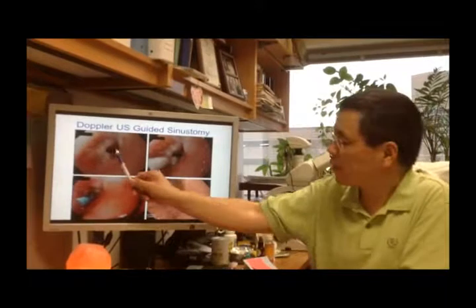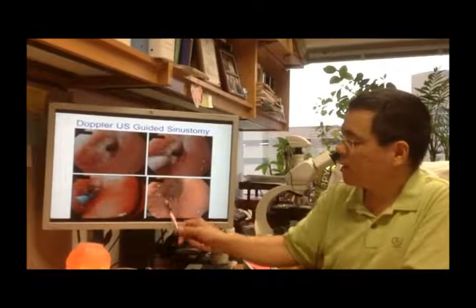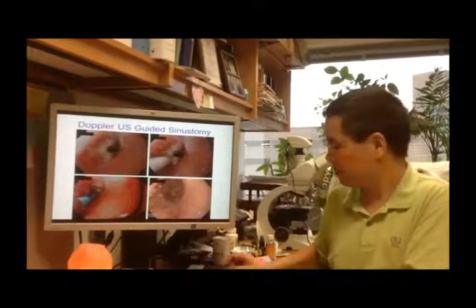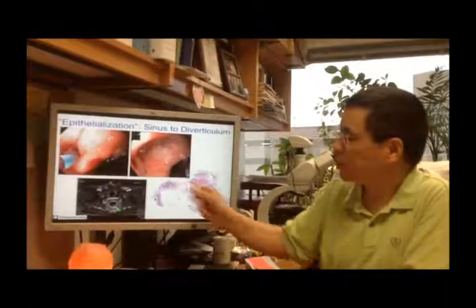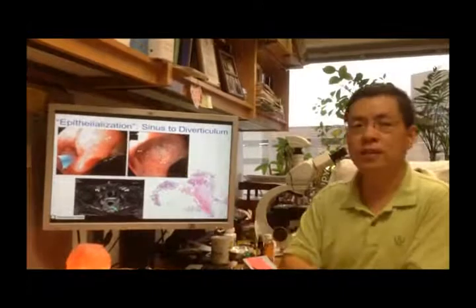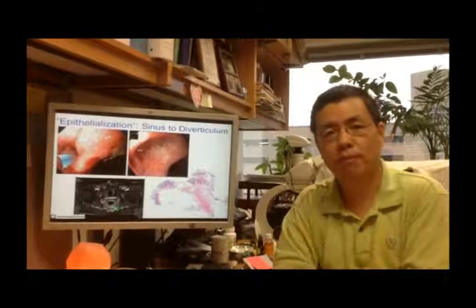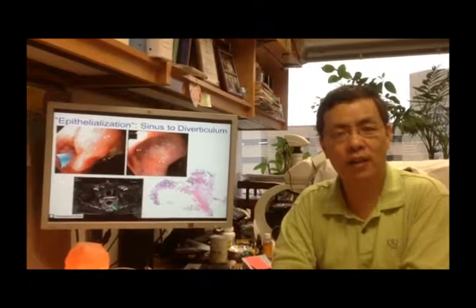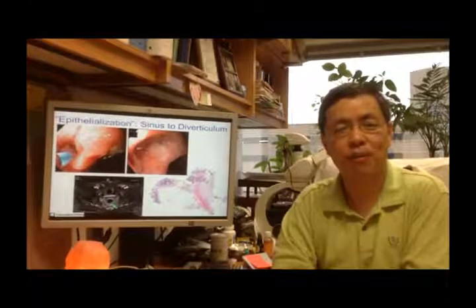This is the sinus here. The ultimate goal is to let the sinus become epithelialized — an epithelialized cavity or diverticulum — becoming part of the pouch. To prove the concept, we took biopsies of this healed sinus. The biopsy mucosa showed ileal mucosa, meaning the sinus cavity is totally epithelialized. We reached our goal of making the sinus a diverticulum. In summary, endoscopic therapy provides a valid, safe, and effective way to cure this detrimental surgical leak or pouch sinus. Thank you very much.